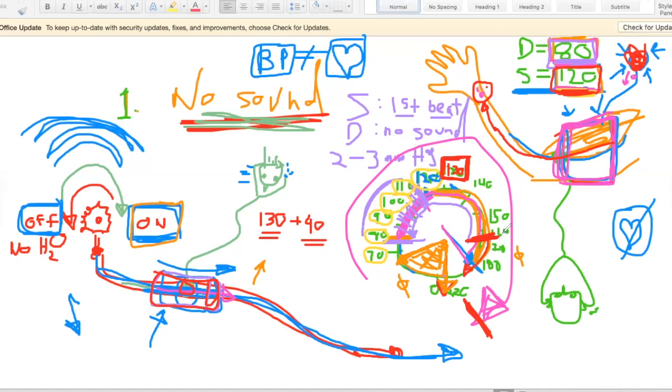And then from the estimate, I can reduce 2 to 3 millimeters of mercury. I'll end up hearing at just about what the estimate is. So not only does the estimate make it so that I don't have to overcuff, and by overcuffing, I don't mean talking on the phone too long when you're not supposed to be. I mean just over sphygmomanometering.